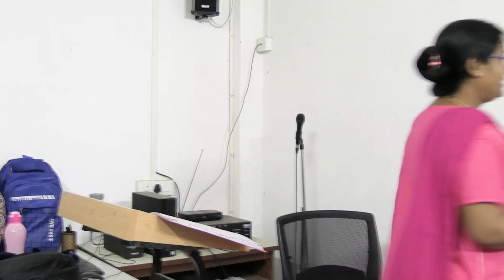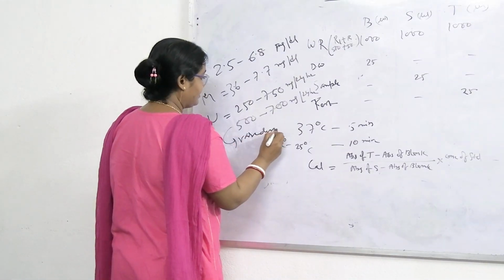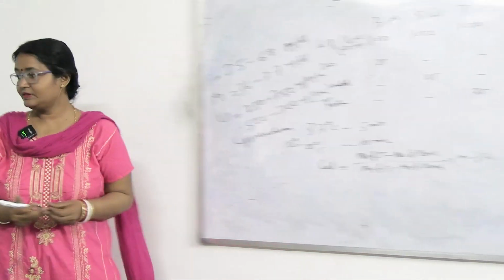Kit, uric acid. In urine, the whole 24 hours average is 250 to 750 for both. This is in Vasudevan and this is in this kit. Urine is not mentioned separately.